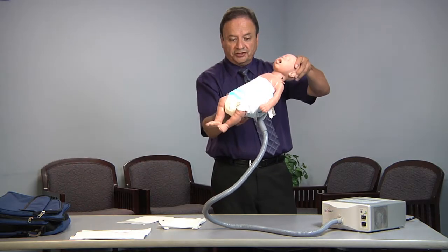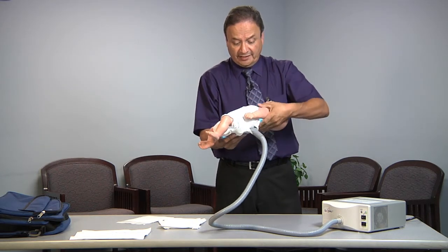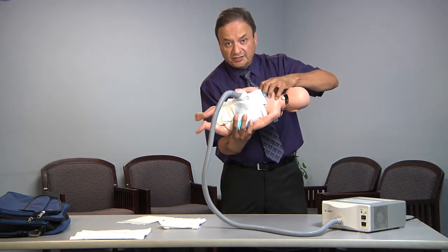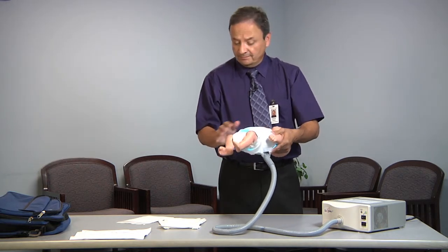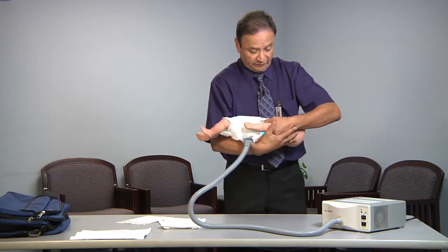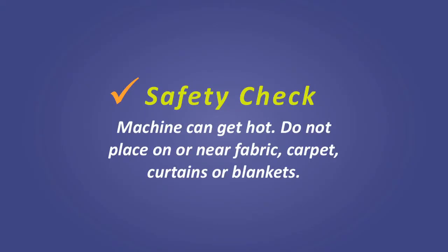And this is how it's going to look on the child. There again, it's not really tight, but it's right there, and just make sure when it moves up it doesn't do the chafing or go over the nipple line. You can feed the baby, you can move the baby around, just never farther than the machine. And remember, there is no heat. This is a fiber optic cable. You never have to worry about any heat. All heat's in the machine itself.